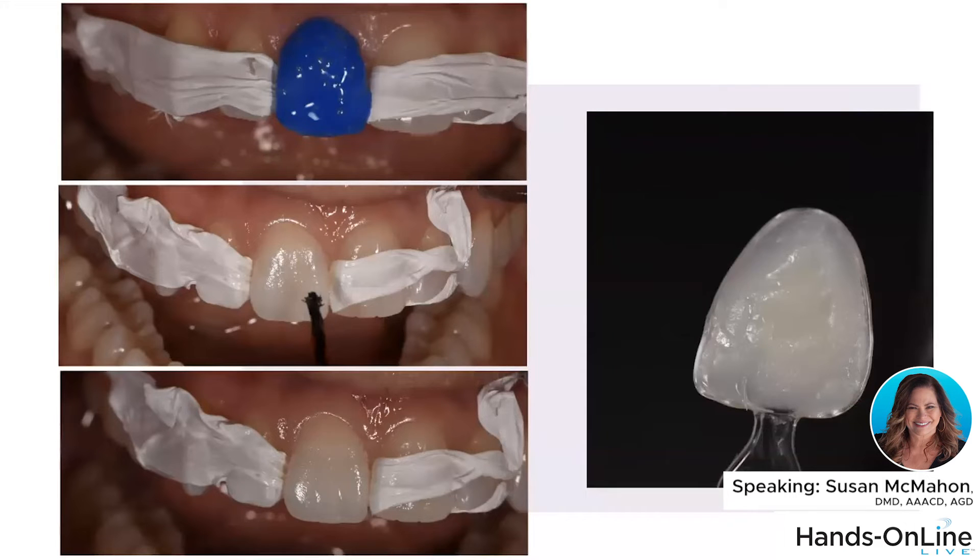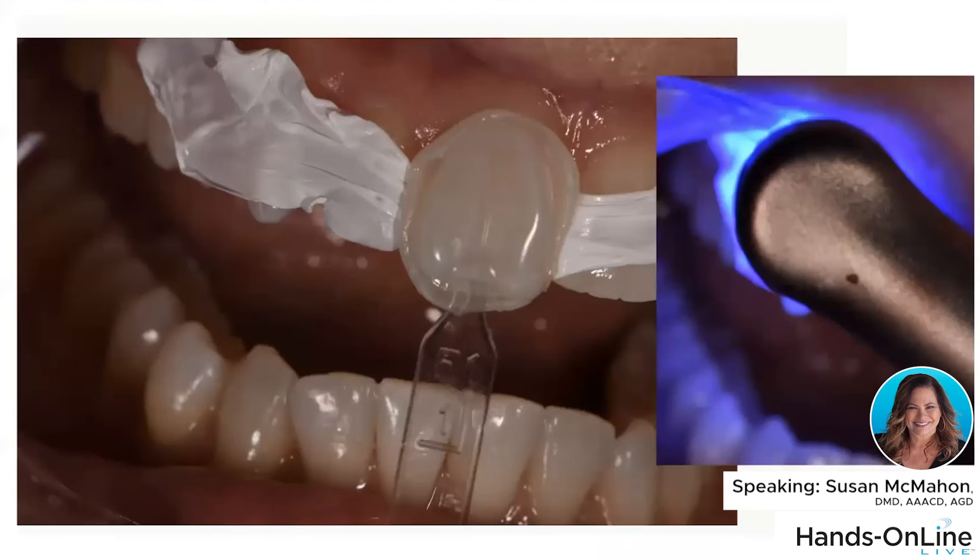You use Teflon tape, a little bit of etchant, then some adhesive, cure it, and you load up your template. It's straightforward — you put some material into it. This is a single shade of white enamel composite loaded into the template, and then you squish that mold onto the tooth. It has a perpendicular aligner on it that allows you to orient it along the long axis of the tooth, helping you get it in the right orientation. Then you take an instrument and clear away the excess.